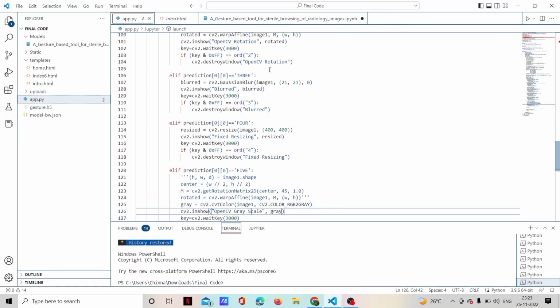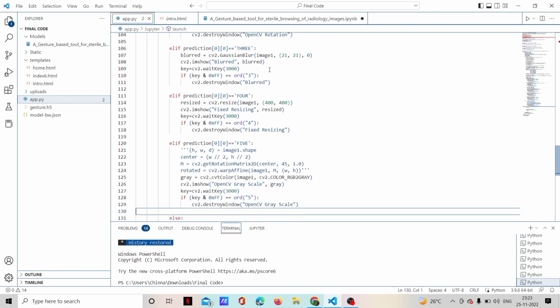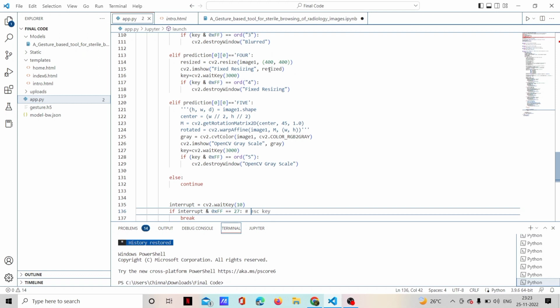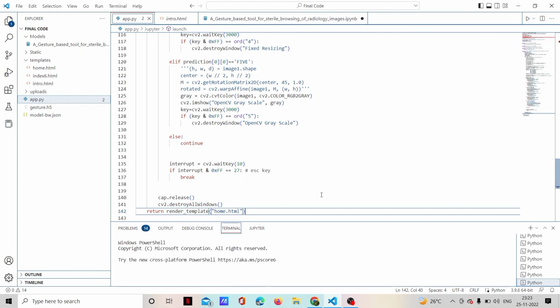So we'll run the program. Here in the console you will find a link. Give Ctrl+click to open the web page. So let's get into the demo of our project.